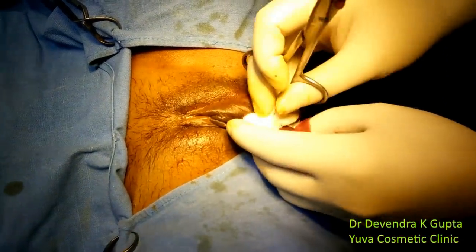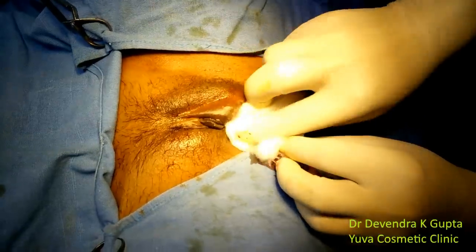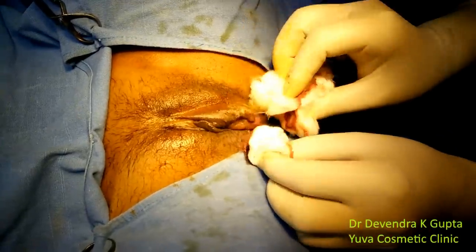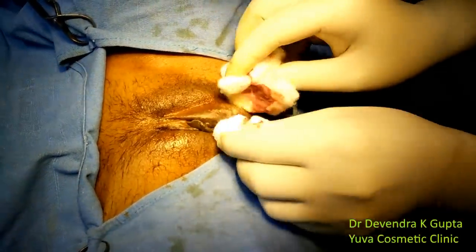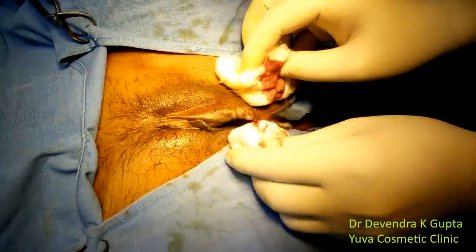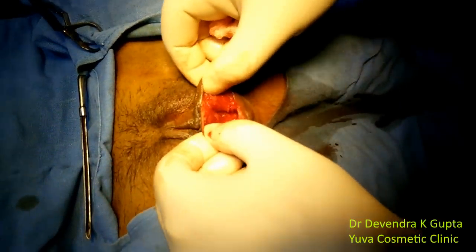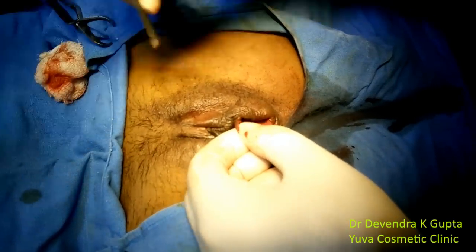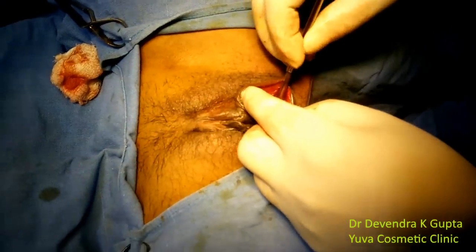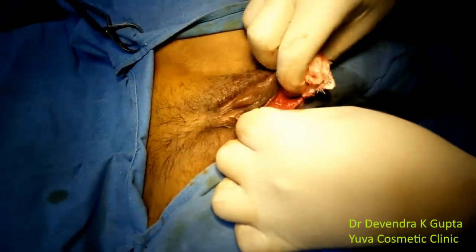I have evacuated the abscess and curetted out all the lining. This is the lower pocket and this is the upper pocket — everything is clean now. We will do some sort of marsupialization.